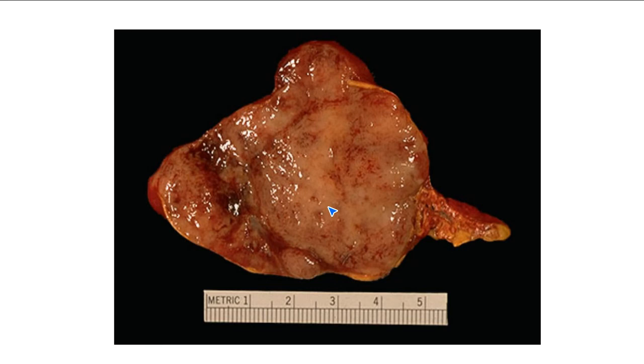Now I was saying that the clue, aha, yes, so lots of vessels. So there's a very rich vascular network that forms a stroma of this tumor. And how are the cells arranged within that vascular network? Are they in papillae? Are they in nests? Are they in trabecula? What's a classic arrangement of cells in a pheochromocytoma? And also in other neuroendocrine tumors, they tend to have this arrangement. Fabulous. So we have these small nests of cells arranged within this rich vascular network, and we call that a Zellballen pattern, remember?